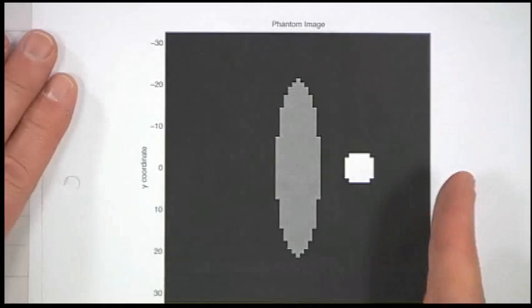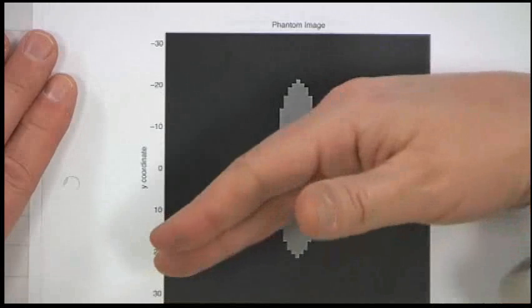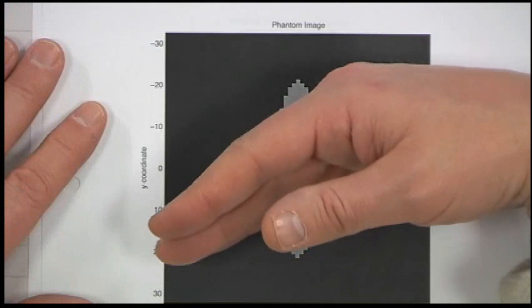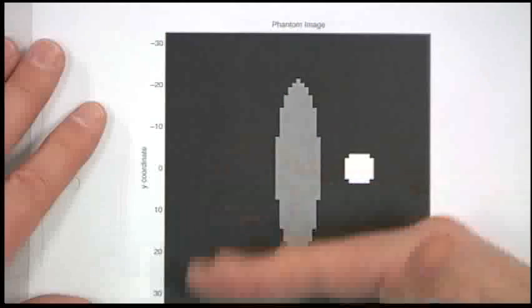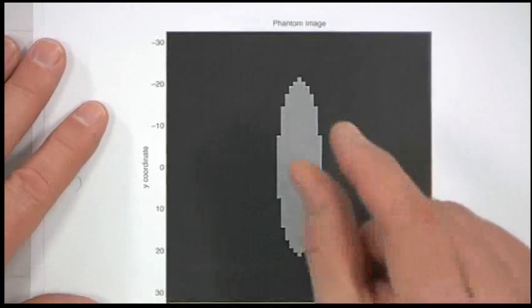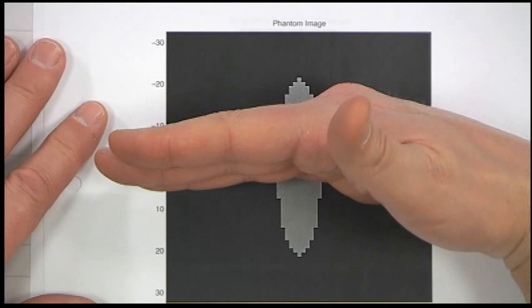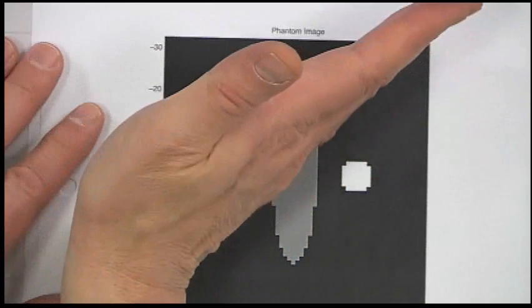Now there's actually, in practice, some value to going beyond 180 degrees. Because, well, first of all, you get multiple measurements of the same thing, so you get higher signal-to-noise ratio. And then they also play some clever tricks, typically. I'm assuming continuous measurement, but in practice it's never continuous. You have to discretize it. So you have detectors that are discrete and that sample it spatially. And if you're clever and you offset the detectors correctly, your measurement in this way will be just slightly different than your measurement that way, because the sampling will be offset.